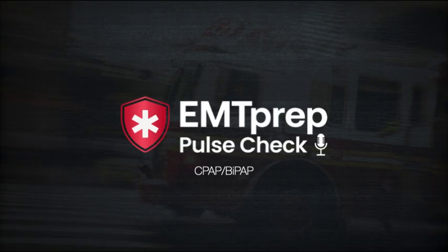If your patient is experiencing pulmonary edema and is most likely in respiratory distress, CPAP or BiPAP would be a good place to start, especially if used in conjunction with nitro and furosemide. CPAP and BiPAP are going to provide that non-invasive positive pressure ventilation that'll help reduce preload, afterload, and venous return. So that'll help reduce the amount of pulmonary edema in the lungs. It's also going to help shift fluid out of the alveoli.